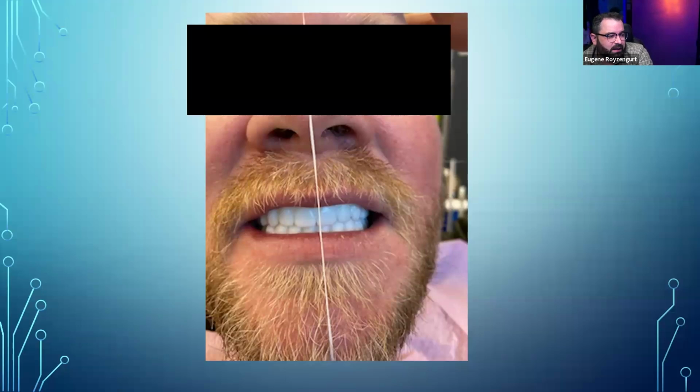So one of the last things that I want to show you guys, because we're running out of time, we've got about 10 minutes left and I want to answer some questions, is Gothic arch tracers. Gothic arch tracers are a very important part of doing a full mouth reconstruction. A lot of times you will have a loss of centric relation and you need to reestablish it. If you don't do that, you're going to run into some major issues.